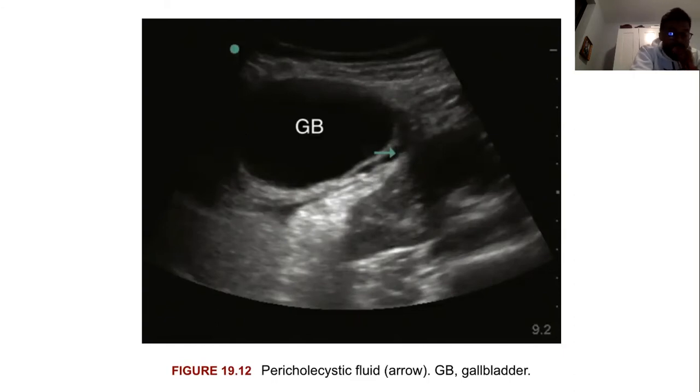Another thing I want to say is, if you have fluid around a structure, like this gallbladder, you can see the outline of it, a nice circle. But when there's fluid surrounding something, it messes up the normal delineation of the anatomy. So it'll look like there's a dip here. It looks curved and jagged. The normal anatomy of any organ is not like that. If the borders look jagged and not smooth, especially in ultrasound, it's most likely because there's fluid around it. And you'll see there's an RE case with ascites. The liver looks like that. Cool. Okay, I'm gonna watch one more.